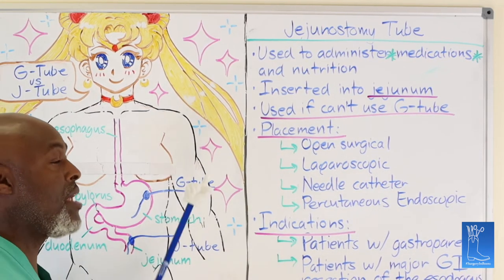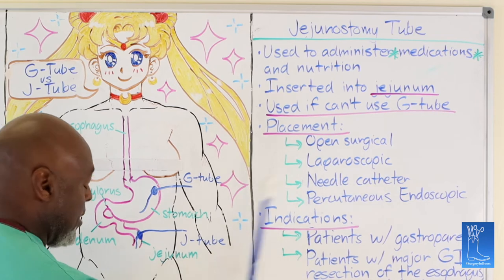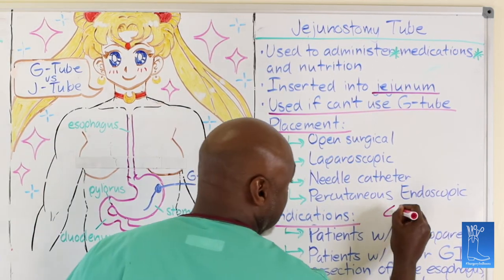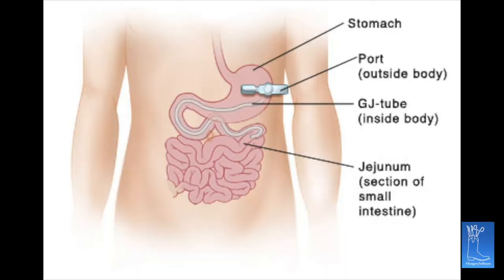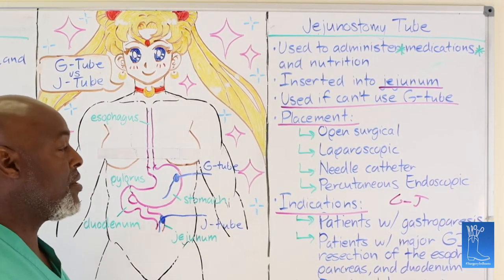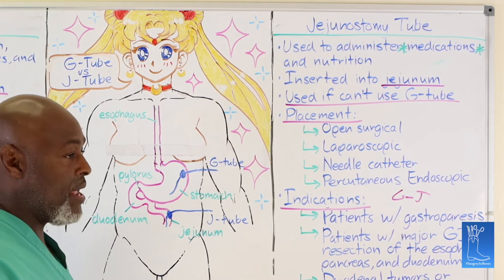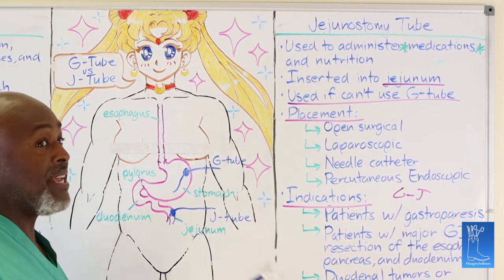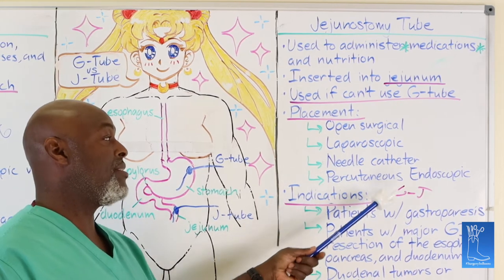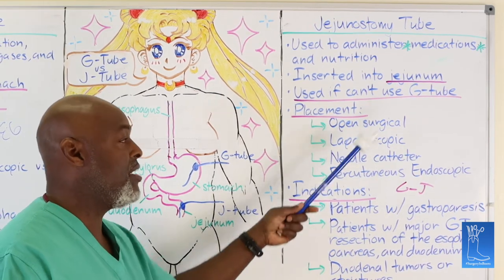Percutaneous endoscopic jejunostomy tubes sort of exist. The reason I say they sort of exist is because what it really is is a GJ tube. What they do is they go in and put a PEG tube in, but that PEG tube has an extra extension that is connected to it, and you feed through the duodenum into the small intestine. So putting in a percutaneous jejunostomy tube is very uncommon. They have some small scopes, but nobody does it because you can hit so much. But they will do a percutaneous GJ tube. So a lot of times, if they say they have a percutaneous jejunostomy tube, it's a GJ extension.